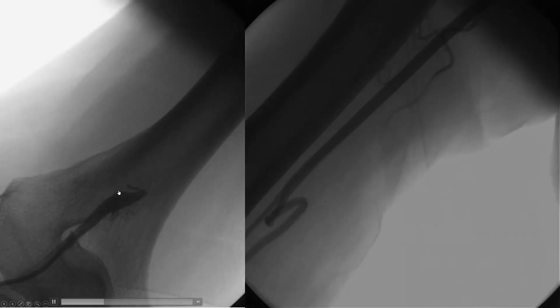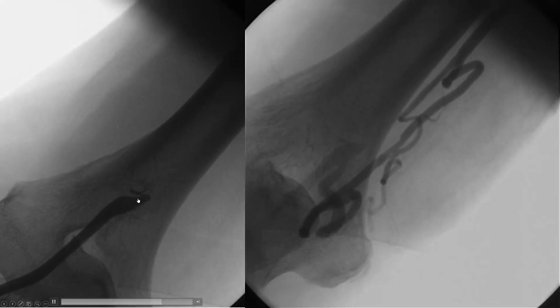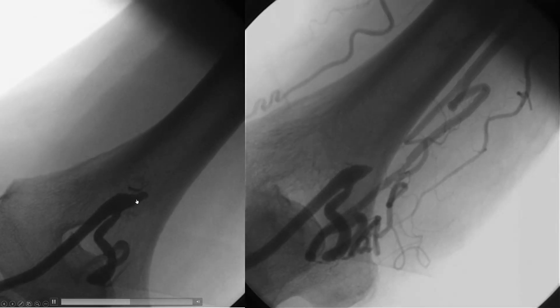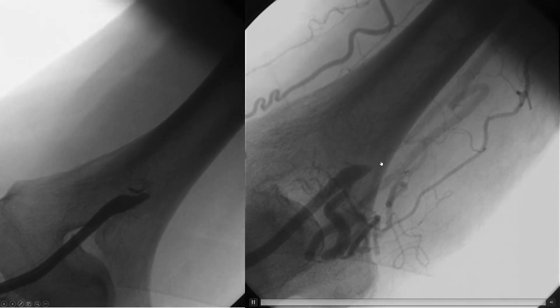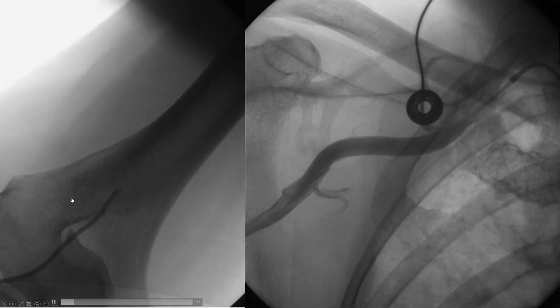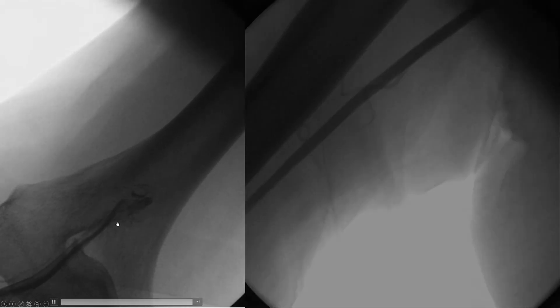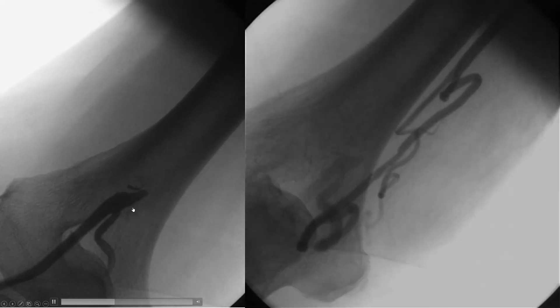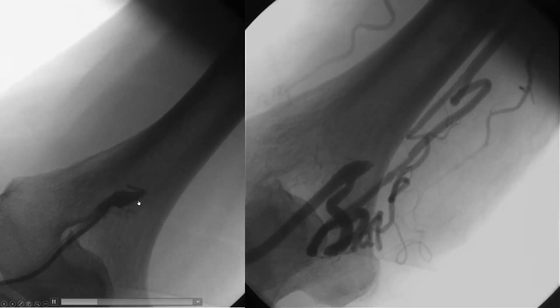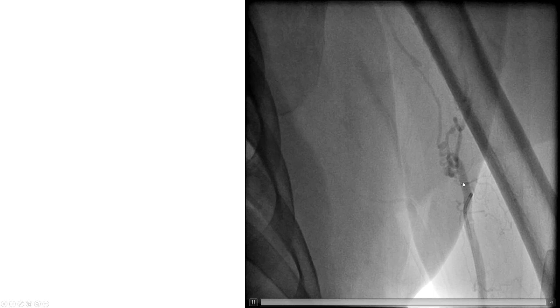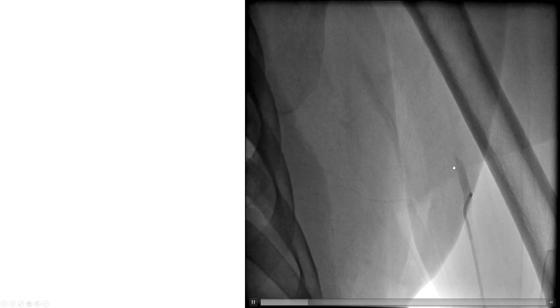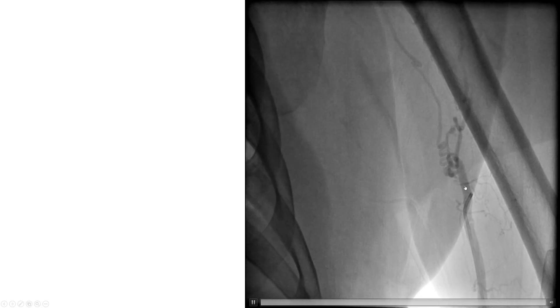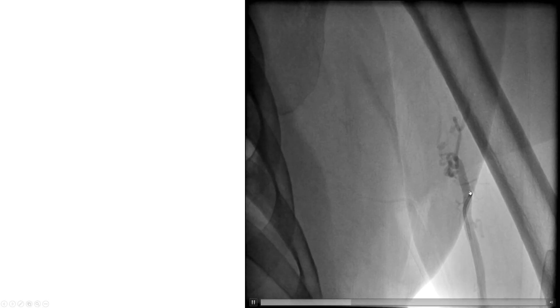Here is an example of radial access limitation. This is a patient with an occluded brachial artery on the right, shown from antegrade and retrograde injection. Obviously, the right radial is not an option for this patient — either left radial or femoral should be used. Similarly, this example shows an occluded left brachial artery; in this patient, left radial access is not an option.